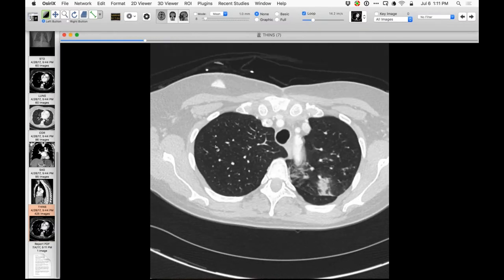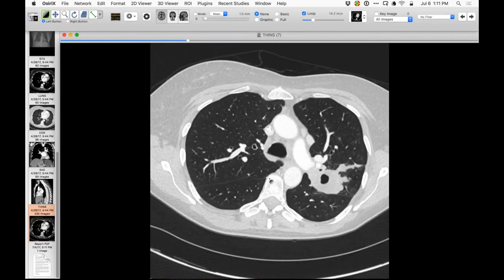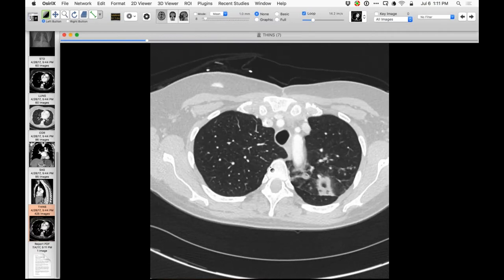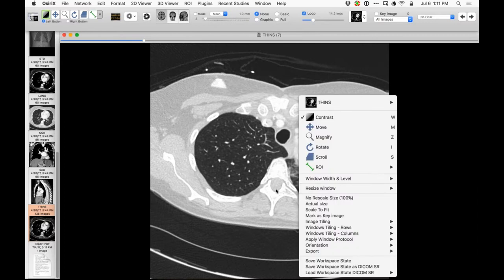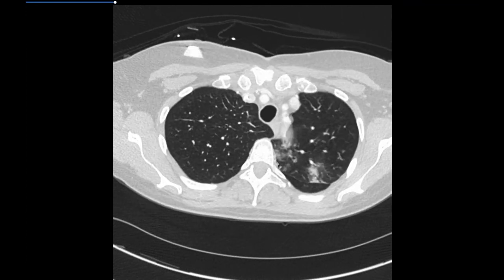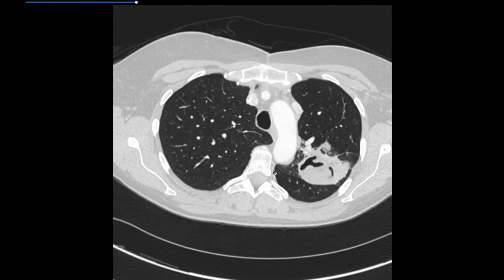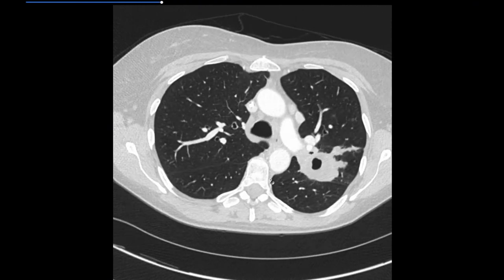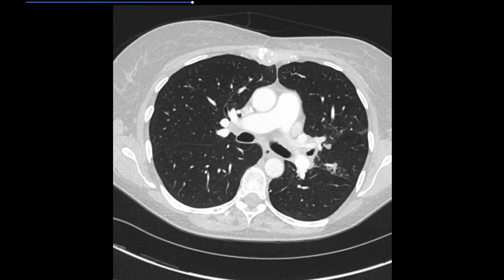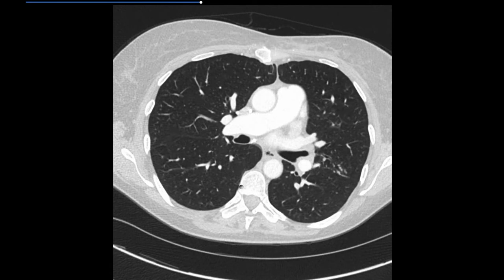When you see a solitary lesion that big with cavitation, that doesn't really make sense for metastatic breast cancer. The other clue that this may not be metastatic disease is that there are some airways adjacent to it containing small amounts of intraluminal material. Anytime we see a cavitary lesion and intraluminal material in adjacent bronchi, one should think of an infectious process - necrotizing pneumonia as an explanation.